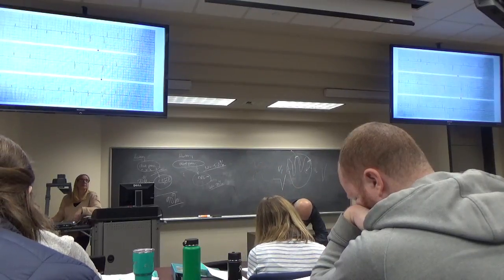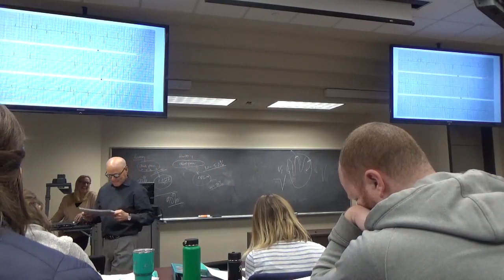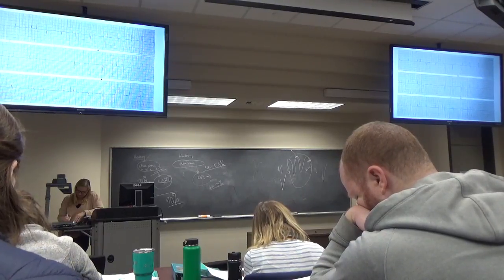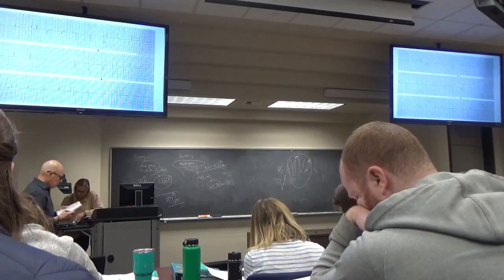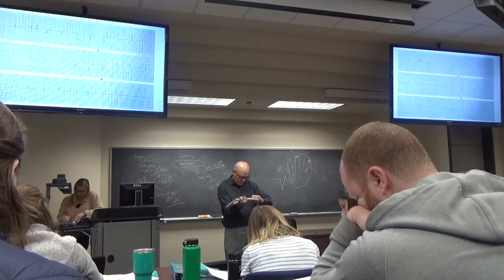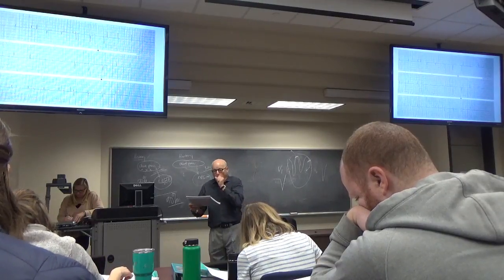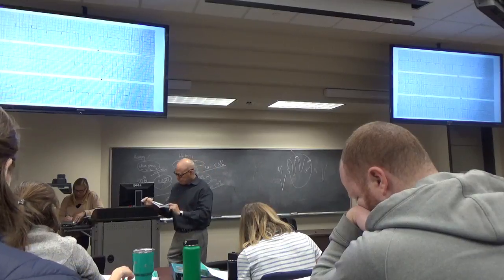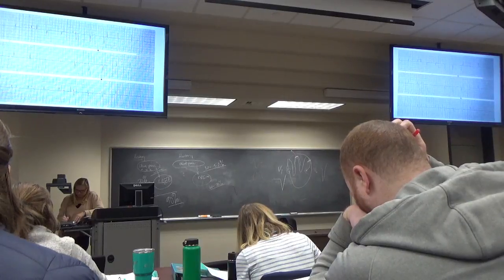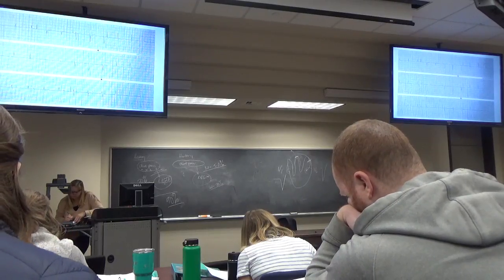Yep. Anterior infarct. Caitlin Shaw. I got sinus rhythm, heart rate of 60, PR of 0.2, QRS of 0.04, QT 0.6, the frontal axis is normal, and then in lead 1, V2, V3, and V4, T wave inversion, and then I have anteroseptal with a question mark. Anteroseptal what? Infarct. What defines an infarct on an EKG? Q waves. See Q waves in V1, V2, V3, and V4.